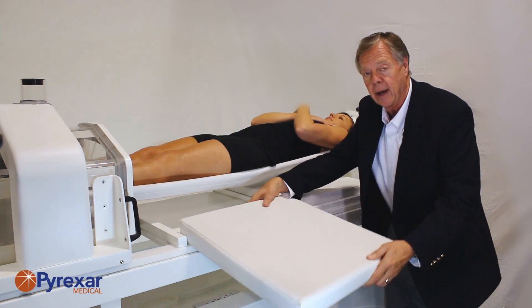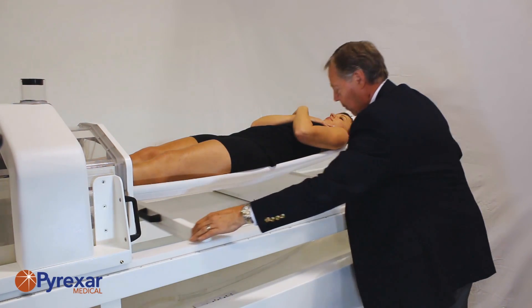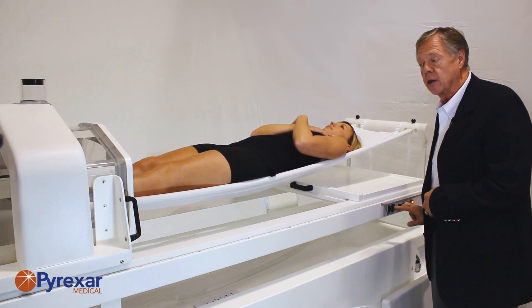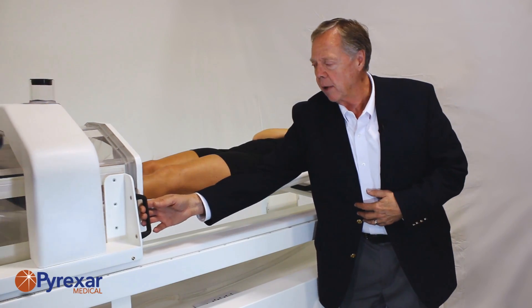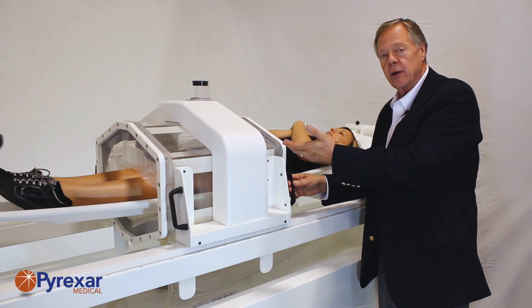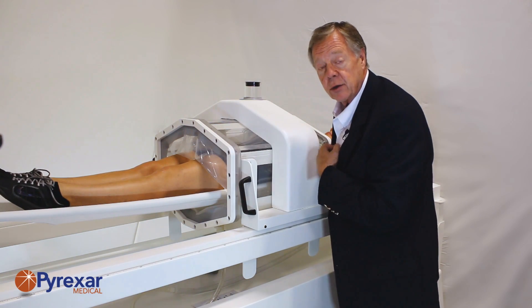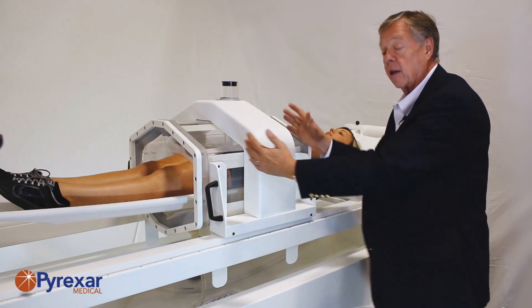Once the body is elevated significantly, we remove the support pads and transport the support mechanism to the side. The next step is to lower the patient to a centered treatment position so they'll be centered in the phased array. Once we position the antenna over the body into the treatment area, we may be inserting temperature sensors — either before in catheters or afterwards. For example, if positioning in the pelvic area, we would have placed catheters there to insert temperature sensors and monitor the temperature. Centering the applicator on the treatment target area, like the pelvic area, is what we're doing now.